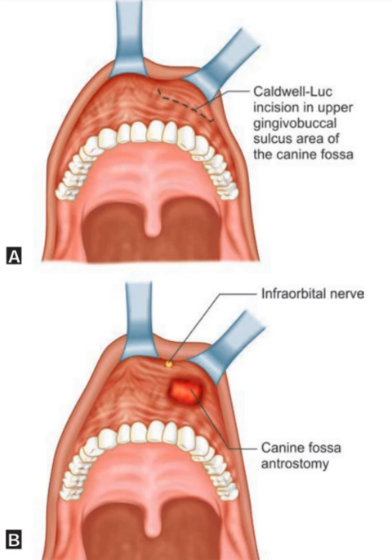Removal of disease. The maxillary sinus pathology and diseased mucosa, cyst, benign tumor, and foreign body can be removed with elevators, curettes and forceps. Luke's forceps can be used to remove polyps, growth and bone pieces.